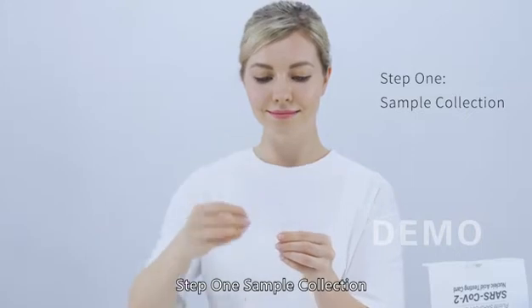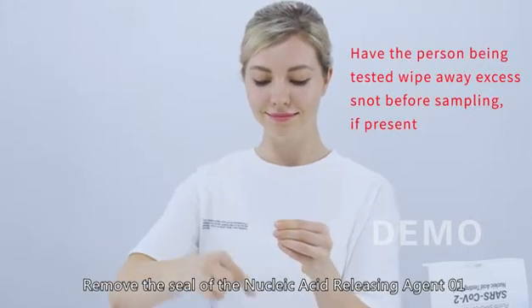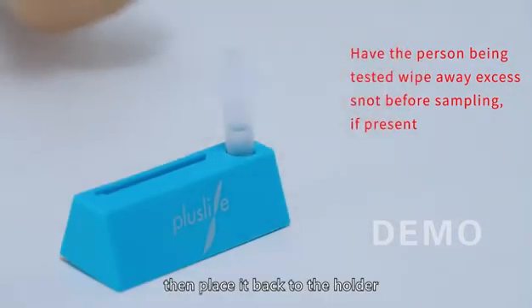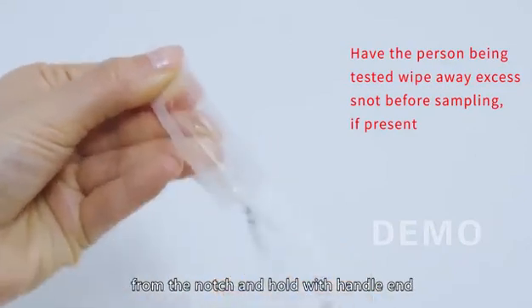Step 1 - Sample Collection: Remove the cap of the nucleic acid releasing agent 01, then place it back in the holder. Take out the disposable sampling swab from the notch and hold it by the handle end.